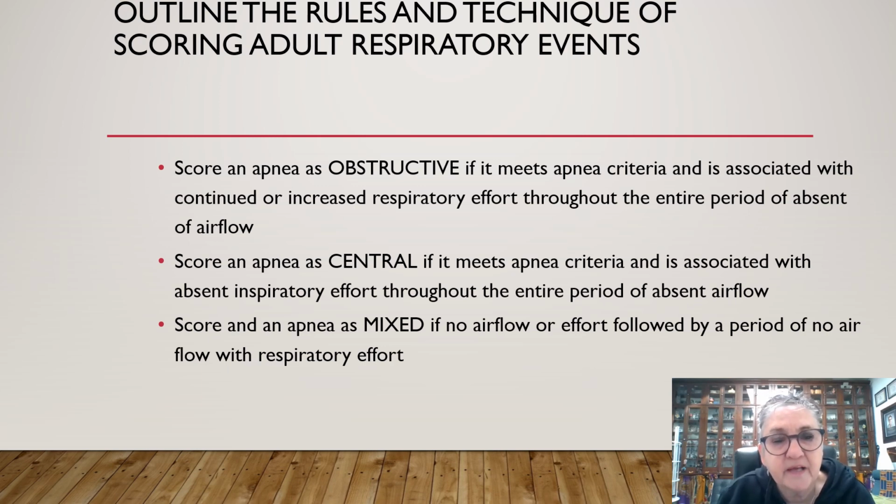Score an apnea as central if it meets apnea criteria and is associated with absent inspiratory effort throughout the entire period of the absence of airflow. And score an apnea as mixed if there is no airflow or effort, followed by a period of no airflow with respiratory effort.